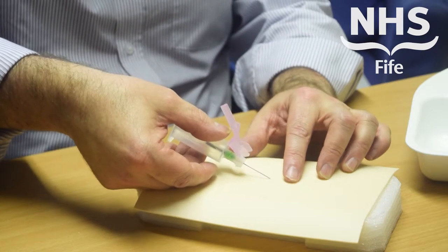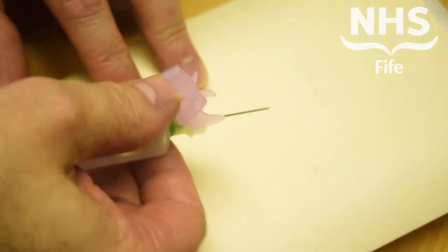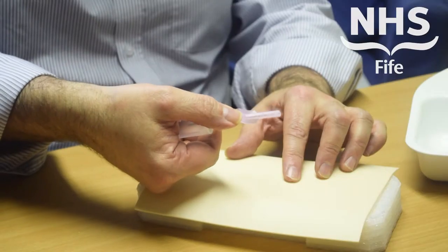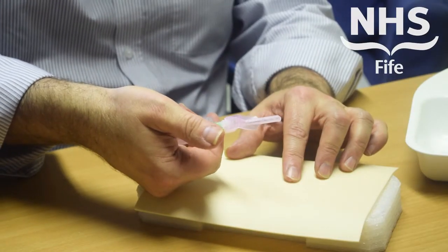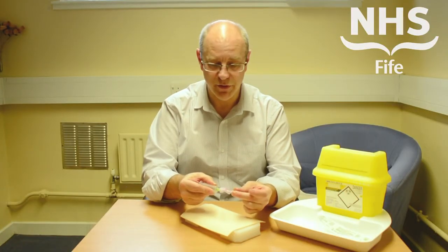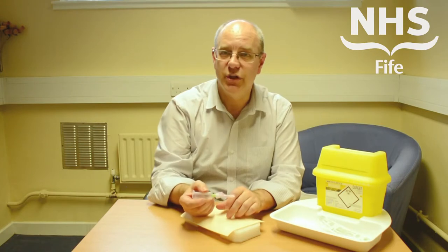We want to make sure that the safety device is activated as soon as possible. That's done simply by pushing down on the thumb part of the device until you hear it click, at which point the device is activated. As you can see, it's not going to come off, and that can go straight into your sharps bin.